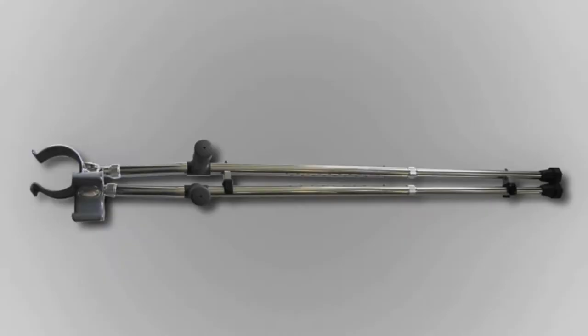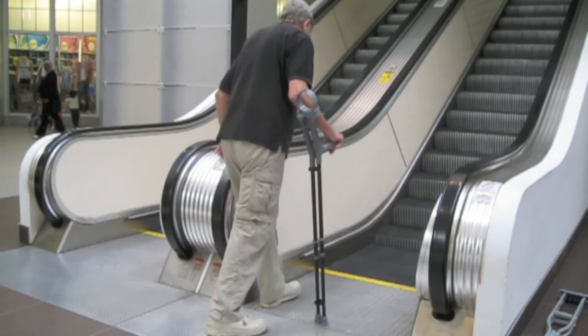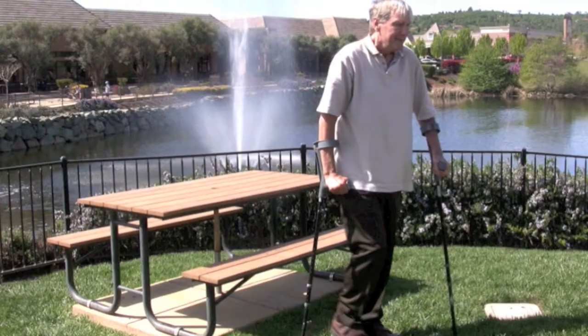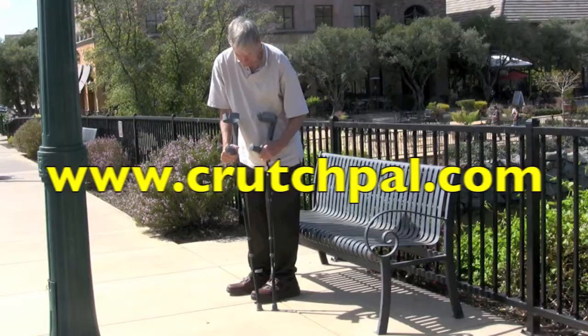And finally, adjustability — you want your crutch to fit your body, and the Crutch Pal is completely adjustable. Now go out and face the world boldly. If you'd like more information, go to www.crutchpal.com or call 408-966-4365. You'll be glad you did.